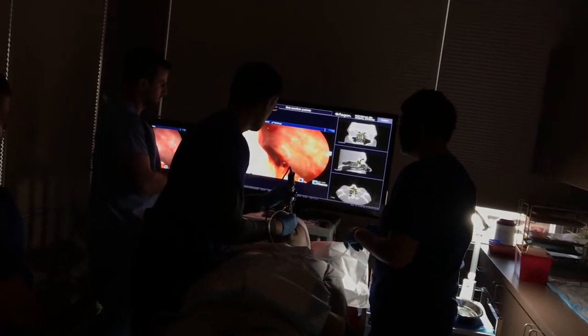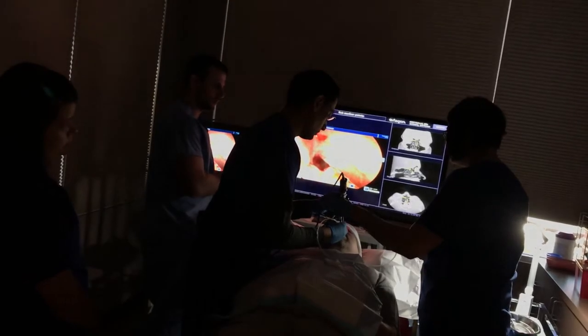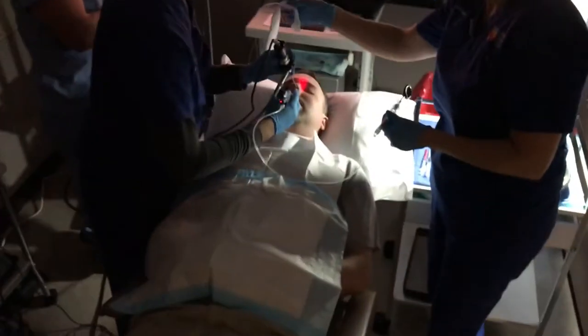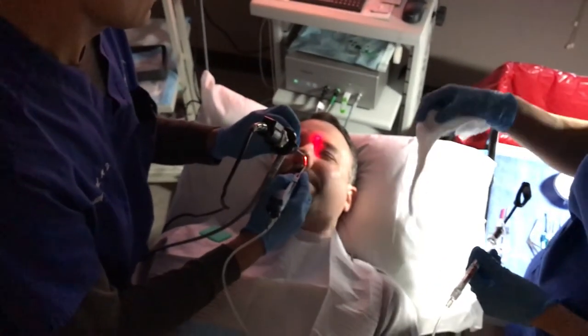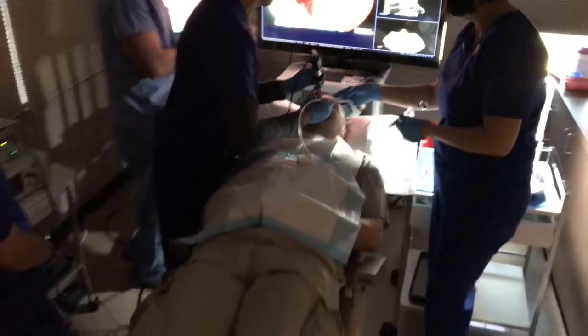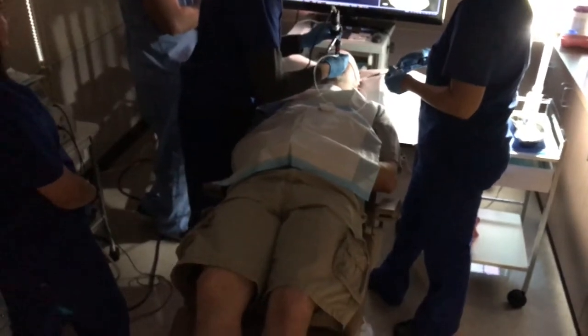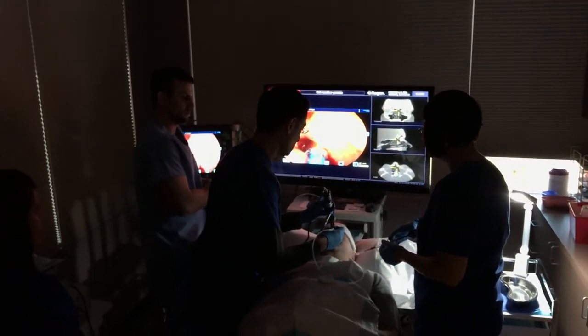Because we need to really — can you pass the — okay, do you want to see that? Take the towel off. Looks like we don't. So it just transilluminates. Can you feel that in your frontal forehead sinus area? I can feel something down below the eye area, but not up in the frontal.